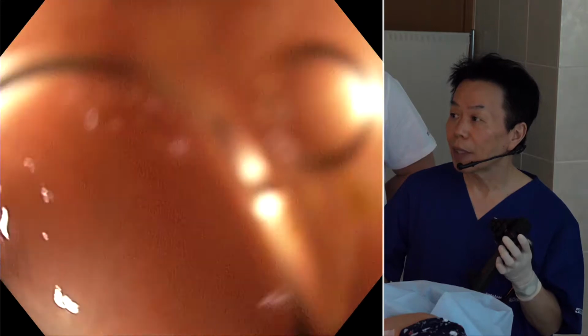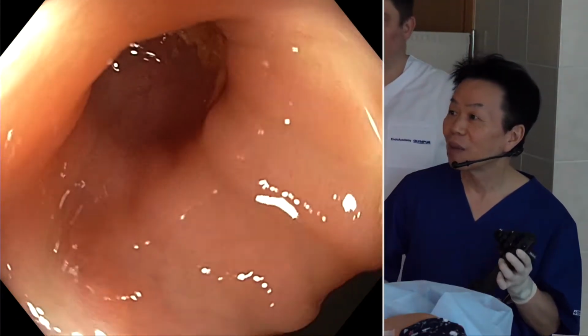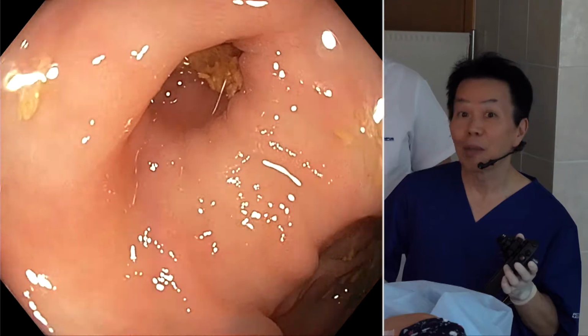So now I think the tip of the scope is in the sigmoid colon, and maybe you have identified some diverticula. So you must be careful not to insert just into the diverticula. Yeah, this is not the true lumen. This is a diverticulum. So you must be careful not to push against the diverticulum.